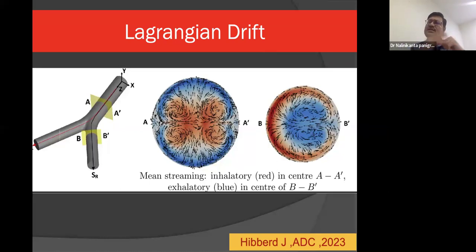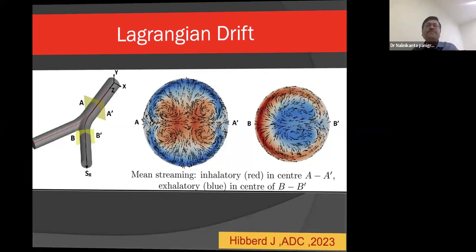The inspiration and expiration happen in parallel, but you can see during the inspiration, in the middle picture, the oxygen centrally diffuses into the lungs. During expiration, the same oxygen peripherally is still going with the dominant force. At expiration time, the dominant blue is central, you can see the carbon dioxide comes out. So in parallel it happens. Both functions happen simultaneously when you use HFO, but in different layers: the proximal layer, the bronchus, the bronchial generation, the alveoli, different mechanisms act simultaneously.